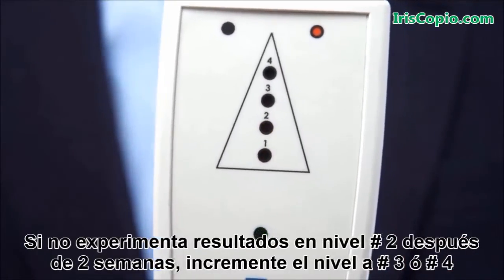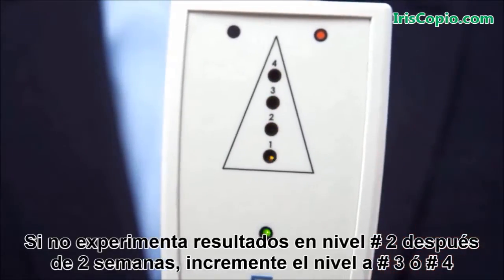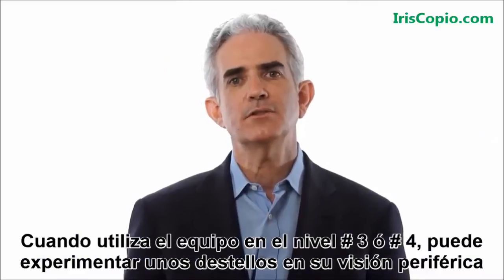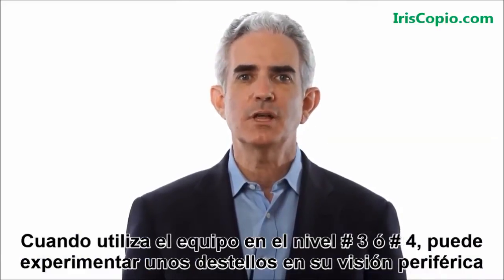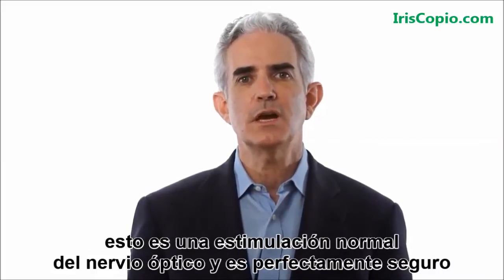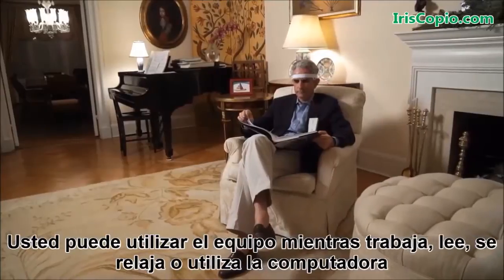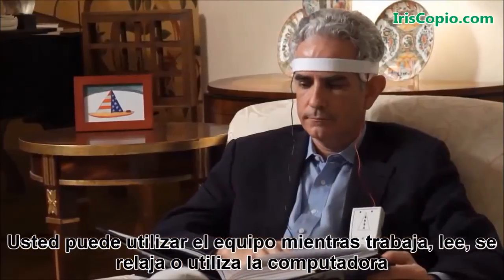If you do not experience results at level two after two weeks, increase the setting to level three or four. If you use the device at level three or four, you may notice some flashing lights in your peripheral vision. This is a normal stimulation of the optic nerve and is perfectly safe. You can use the device while you work, read, relax, or use the computer.